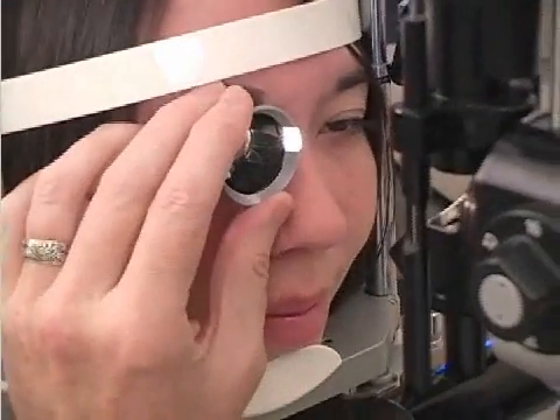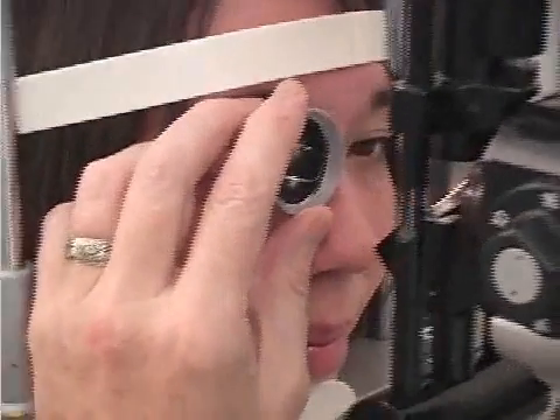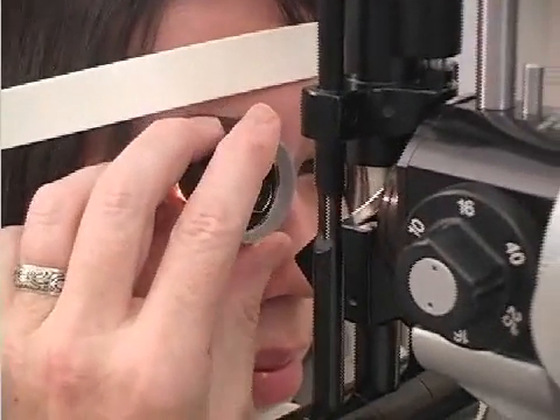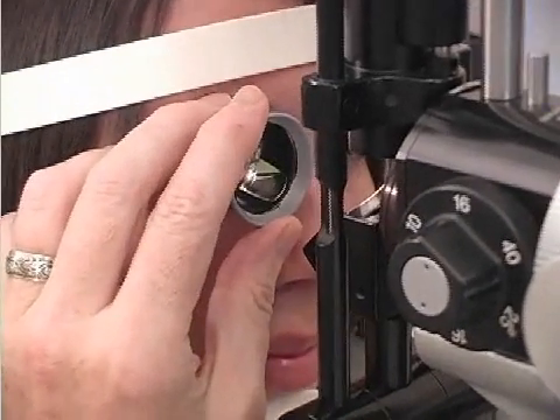I always warn the patient that they will feel material running down their cheek, and I let them know that this material is not harmful. In fact, mouthwash is often made with methylcellulose.